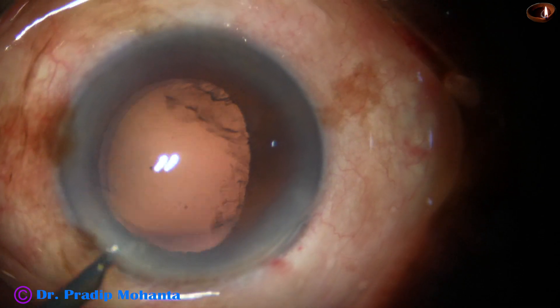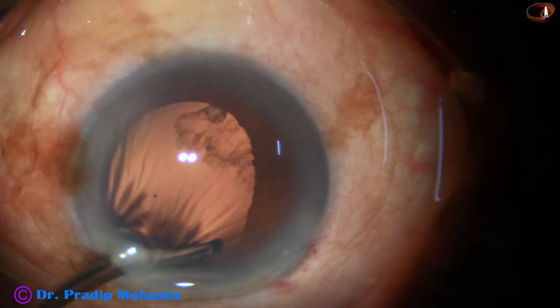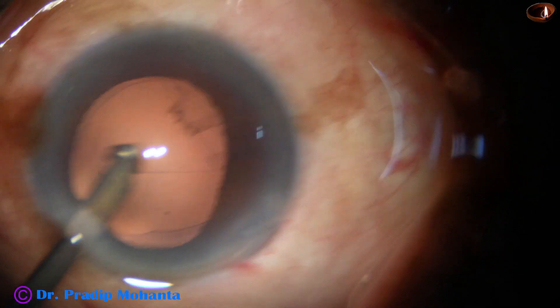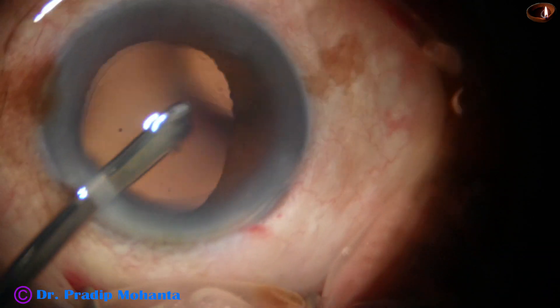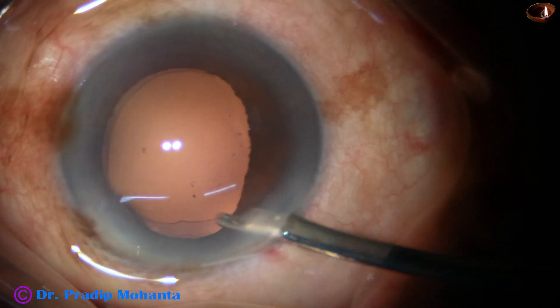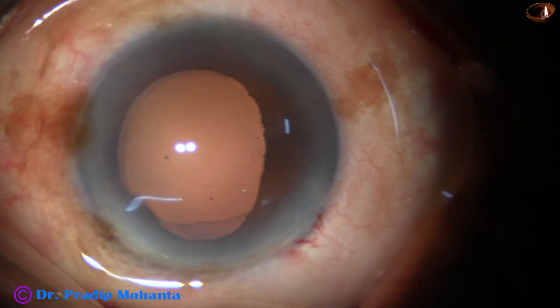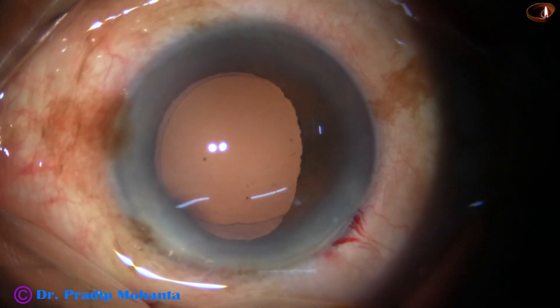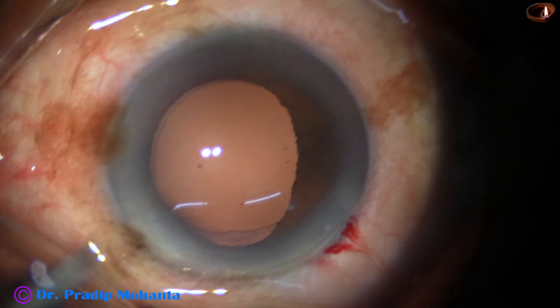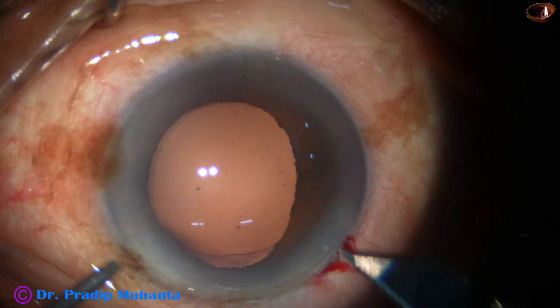This is called trampolining of the posterior capsule — the posterior capsule comes forward towards the phaco tip very suddenly. In such cases we need to protect the posterior capsule, and we can use the epinucleus shell if we can detach it from the nucleus and use it as a contact lens.